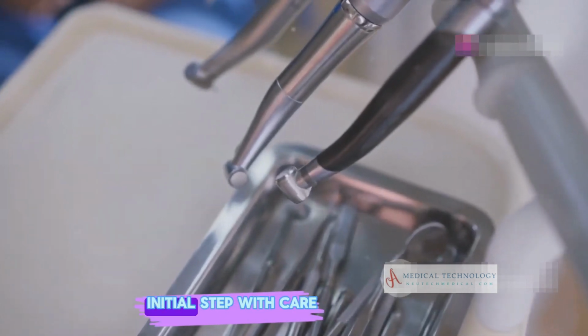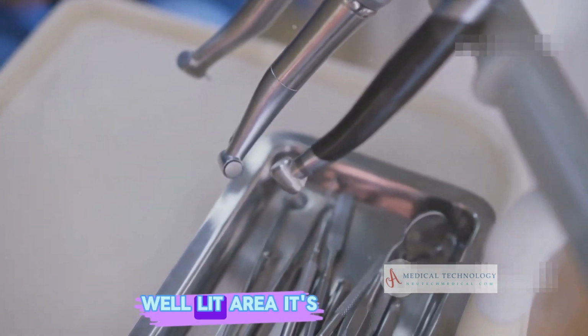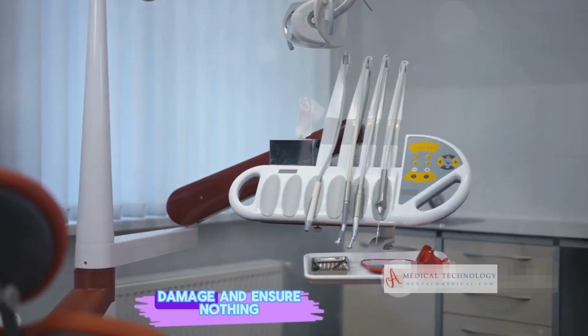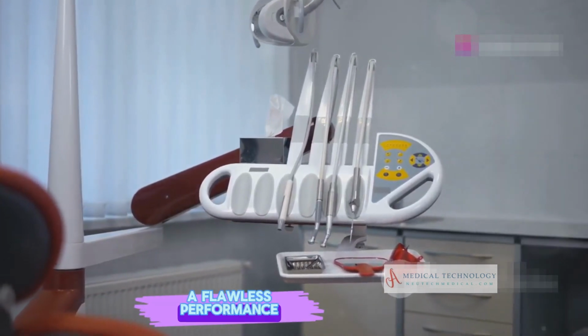One must handle this initial step with care, laying out the chair's components in a clean, well-lit area. It's essential to inspect each piece for any signs of damage and ensure nothing is missing. Think of it as setting the stage for a flawless performance.